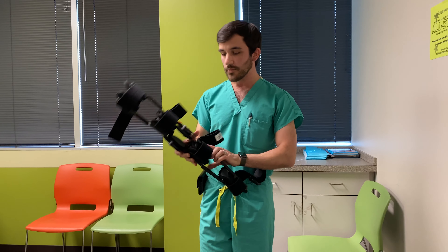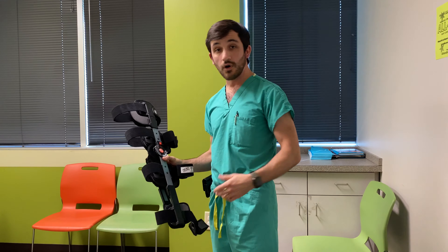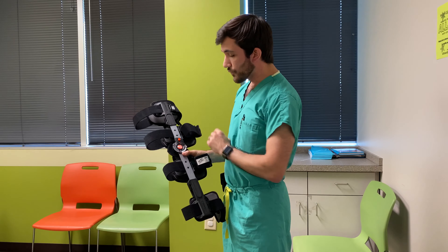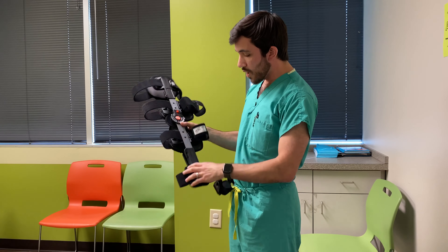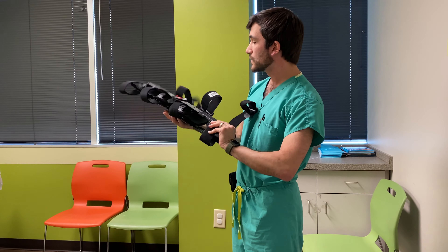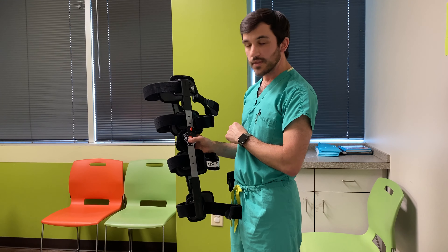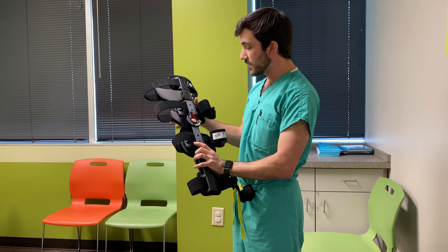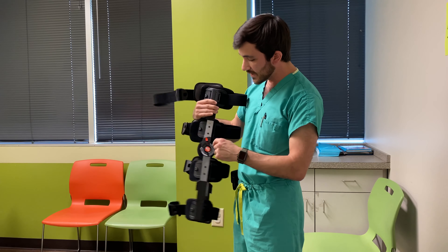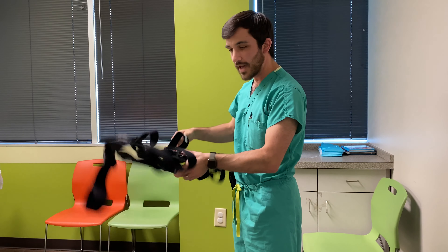Before we start showing you how to put it on, I'm going to show you the different components. First of all, which way is up? There are three different ways you can look at it. One, the square pad will always be on the bottom or facing the toes. Two, this red tab will be closer to the head than the toes. Or three, if you like your alphabet, D's and B's are good. Nines and P's are bad.